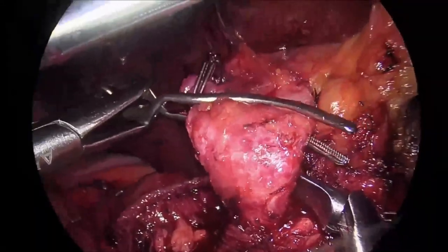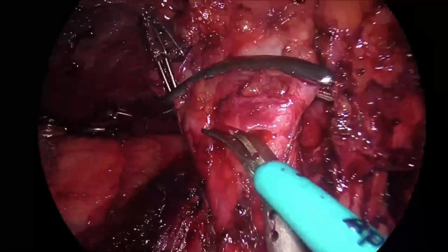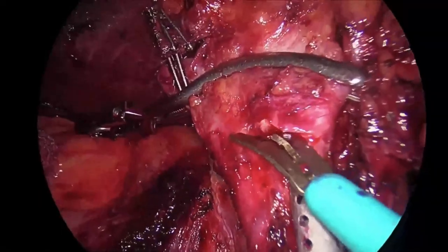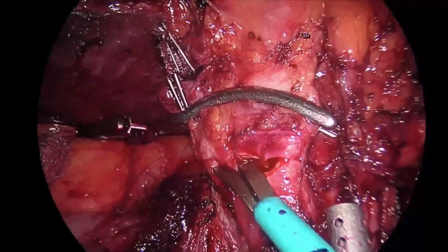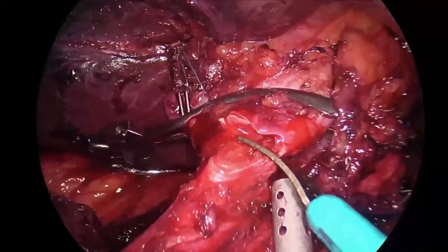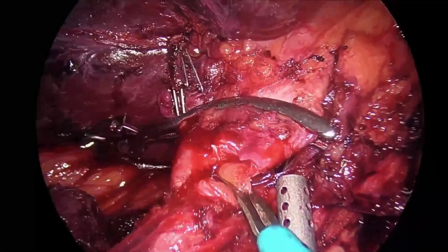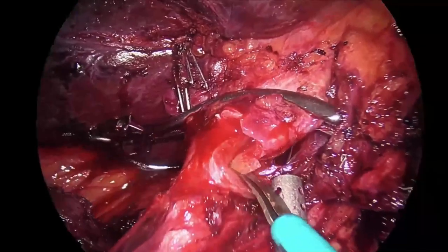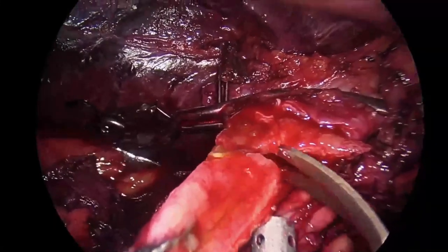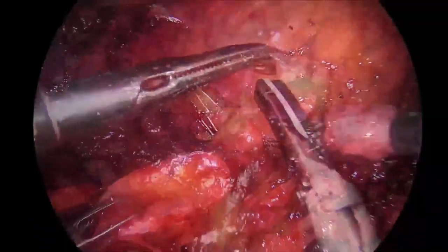A bulldog is placed. Using scissors, the bile duct is opened and divided. The posterior layer is left 3 to 4 millimeters longer — a finger retractor which will facilitate the reconstruction. The distal stump is clipped.